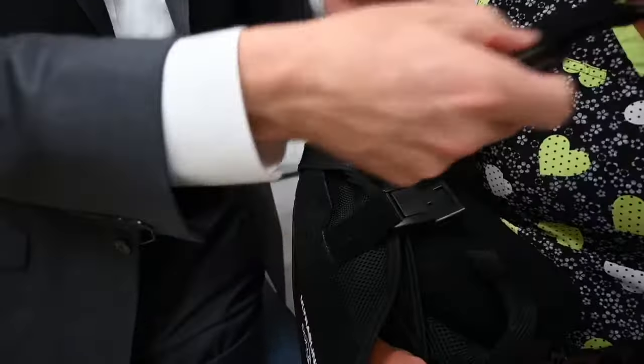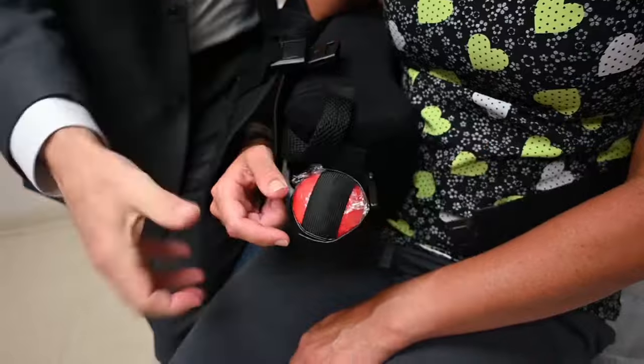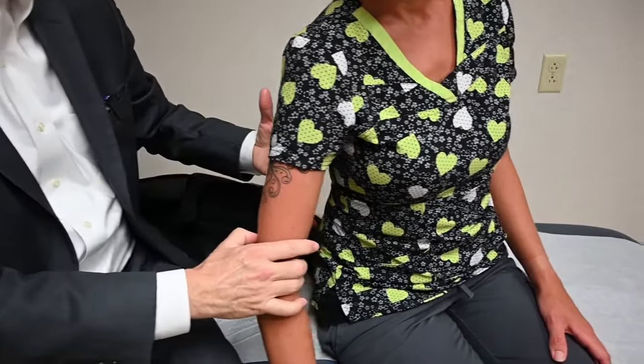Now let's talk about showering and removal of the sling. The only time the sling is fully removed is for showering. To shower, simply remove both clips in the front of the sling — the one around the neck and the clip in the front — and remove the sling. With waterproof band-aids in place, you can let the water go right over the wounds and shower normally. I discourage baths, whirlpools, or swimming pools. When showering, you can lean the body over to allow the arm to drape out away from the body in order to wash underneath the armpit.